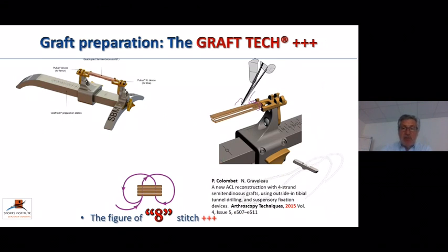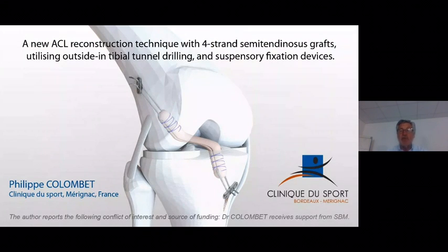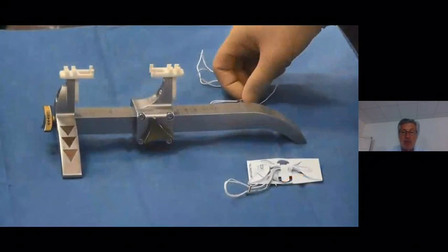The graft preparation, the graft tech, is a very nice thing, not because I drew it and perfected it, but it's very helpful to prepare a flat and very homogeneous graft. You can find the technique on the internet and YouTube, with Arthroscopy Techniques. It's free access. Once again, don't forget to lock the two extremities of your semitendinosus graft. Now we're going to show the movie on this technique, and we'll continue later.